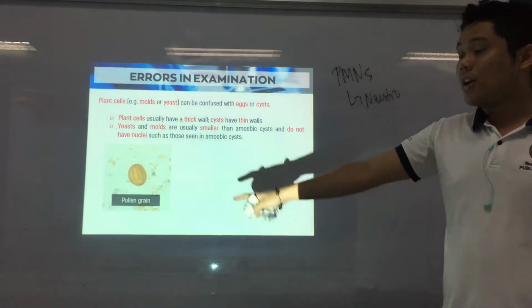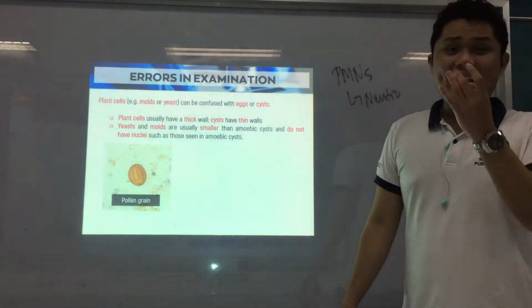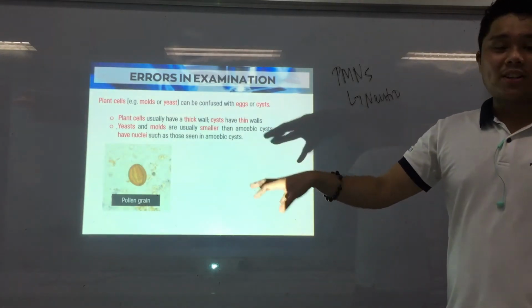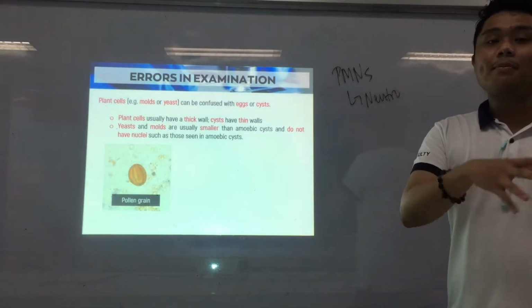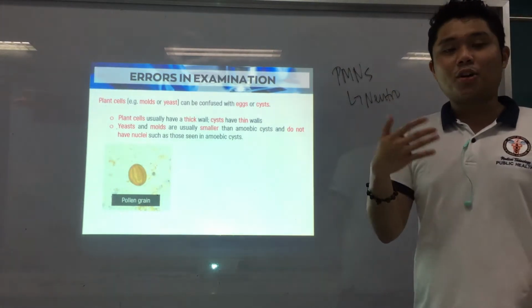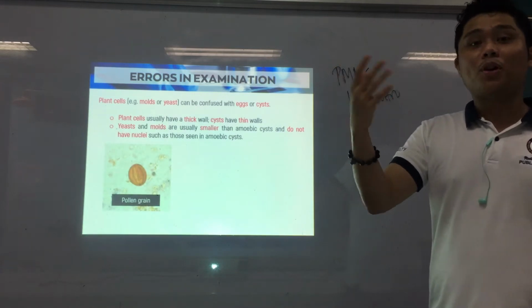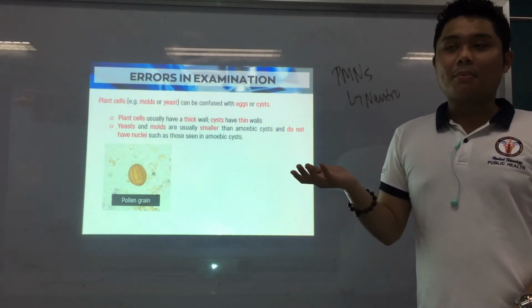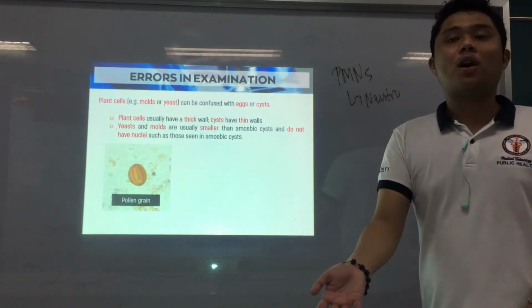Okay, so here's an example of a pollen grain. If you look at it, it looks like an egg of a helminth. But this is a pollen grain. So how does a pollen grain arrive at your stool sample? Same again as in other countries, there could be seasons. Pollens are common in seasons like spring, when there are a lot of pollens that could be airborne because of pollination. So that could happen, that it could be introduced to our stool sample.